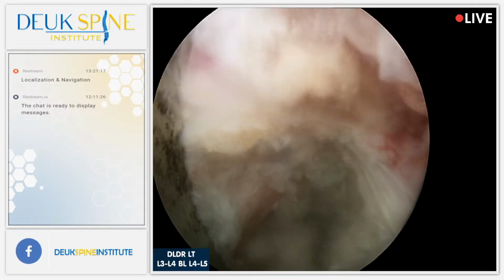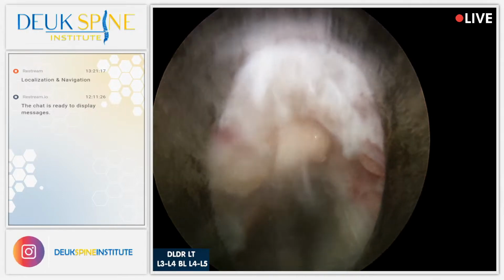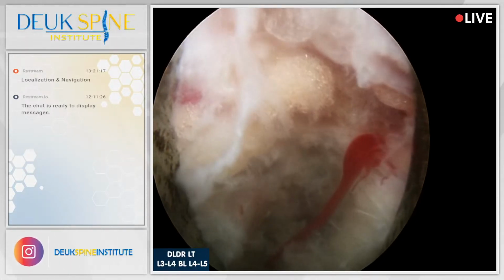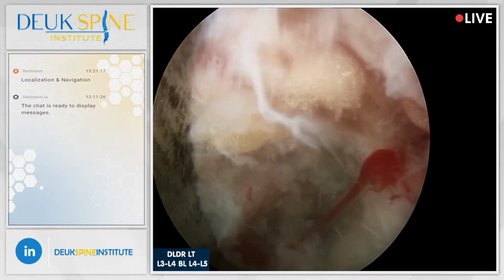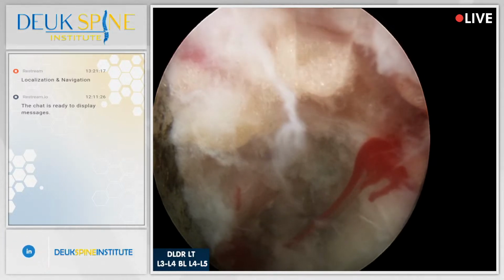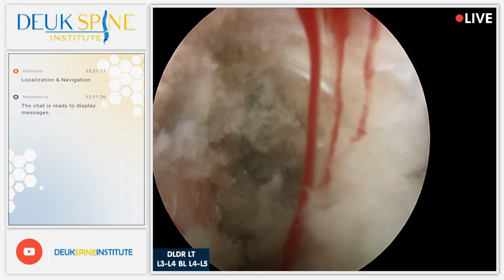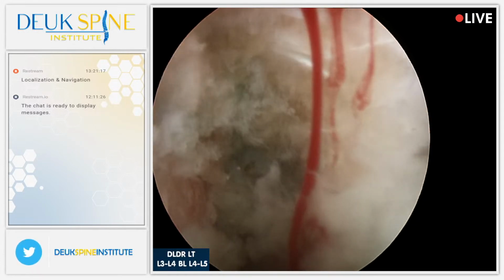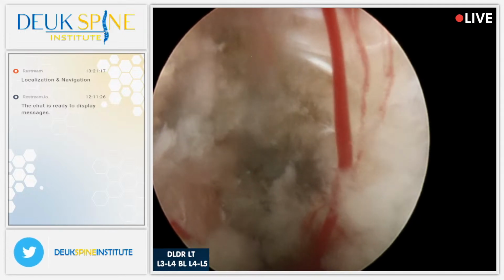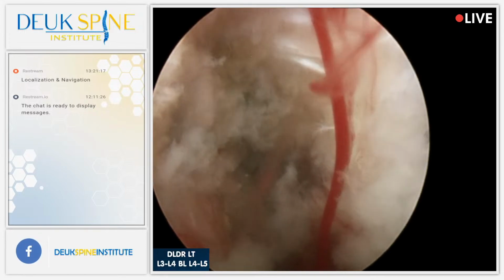You see that drop of oil right there coming out of the fat cells? Let's take a look. There's fat right there, a little blob of fat with little cells. Each one of those little things is a fat cell. Pretty cool. And then you can actually see the red blood cells coming out of this tiny little vein. Let's check it out. Each one of those red dots is a red blood cell. You're actually seeing the red blood cells. That's how zoomed in we are.